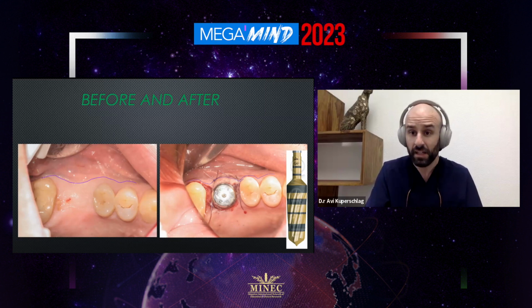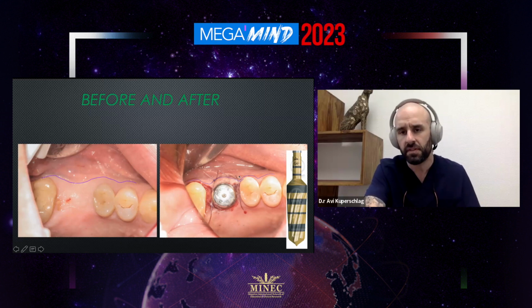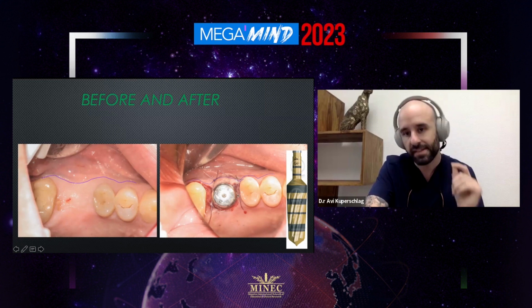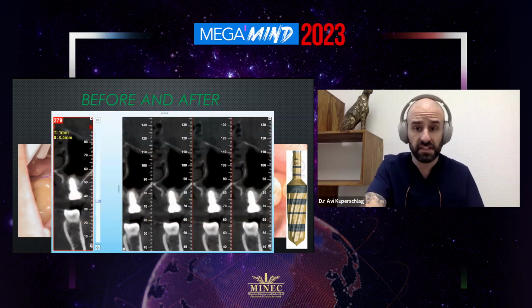But here, as you can see, this is truly minimal invasive. This is minimal invasive surgery that we are solving with a small tiny flap that is fixed together with two sutures. This under any book is minimal invasive. This is right after the CBCT.